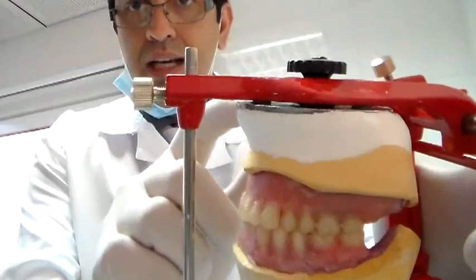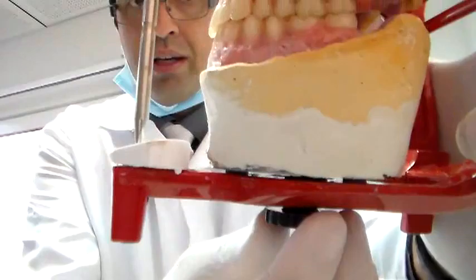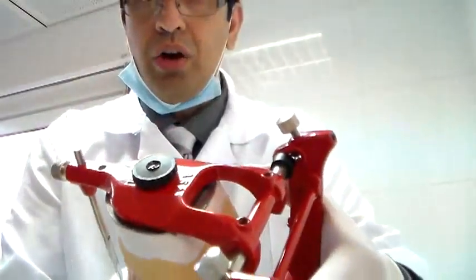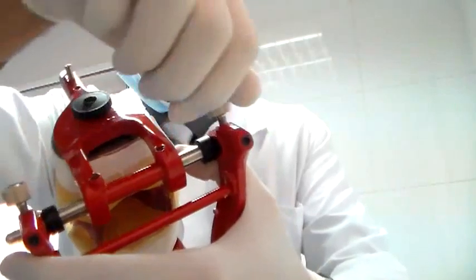Number two, you want to make sure that the plates are correctly attached, not loose — both the upper and the lower plates. Number three, you want to see that the two lock nuts here are completely closed.